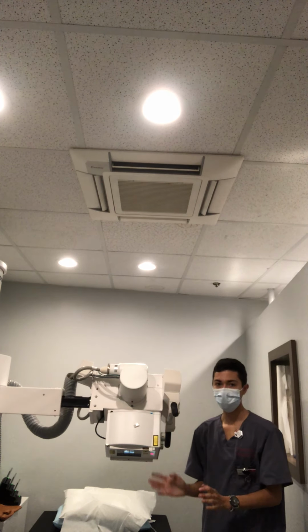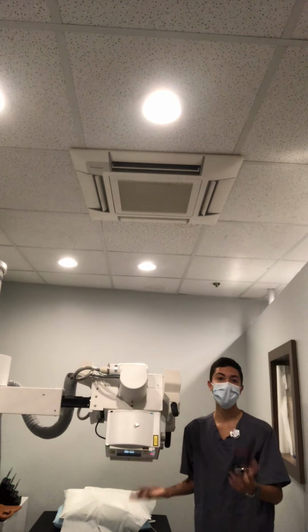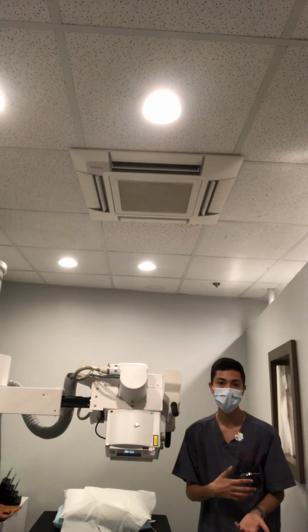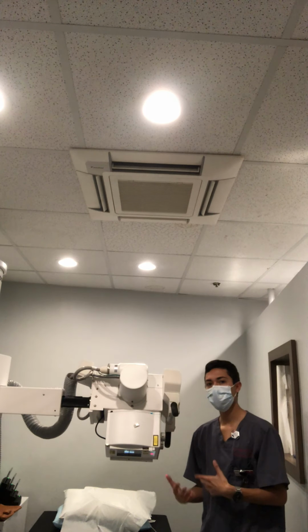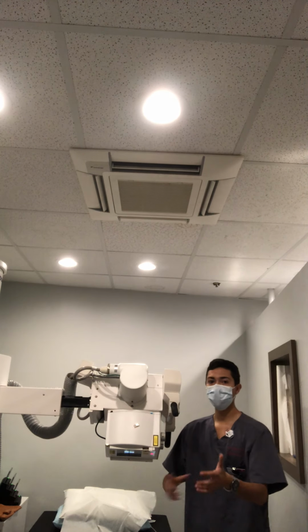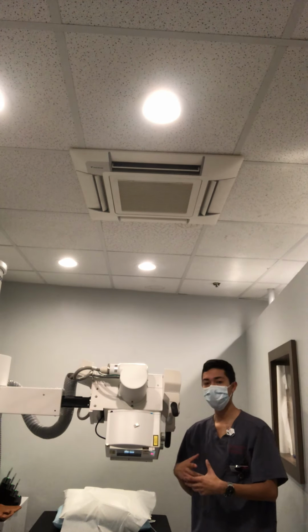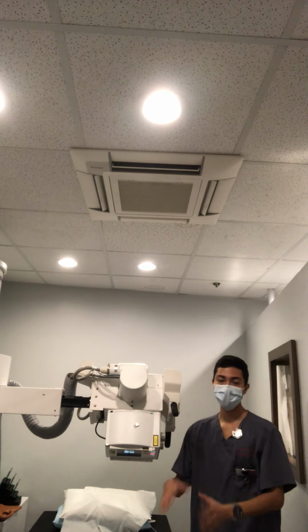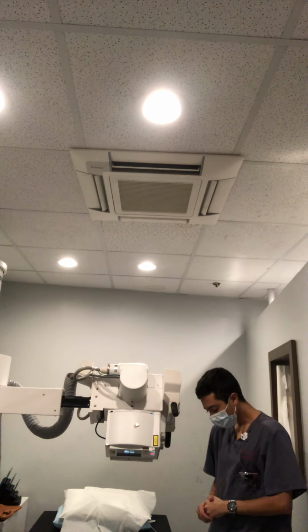Just got to make sure you position them correctly so you don't have to repeat. And sometimes it happens, you may cut anatomy or you may miss it, and that's why, from the first picture you take, you fix your errors, as when we become technologists, it helps us make sure that we actually get it the second time around, because we're giving more radiation to the patient.